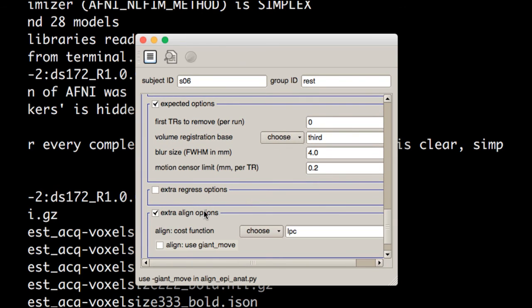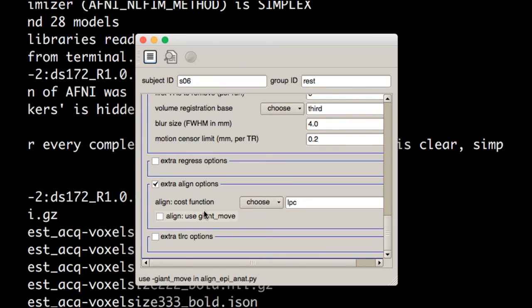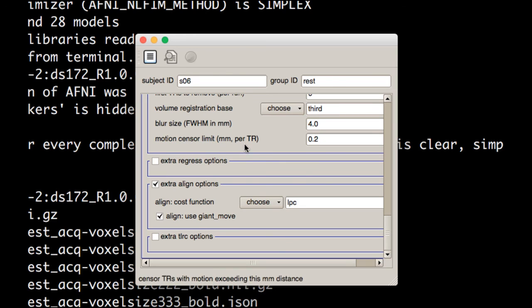Last thing, I didn't go into too much detail on this, but if you were to align the functional image on top of your anatomical image, you would see that they're slightly off, a little bit more than I'll be comfortable with. And so using the giant move option would make sure that they get into a good enough alignment before it starts doing a fine-tuned registration between the two.